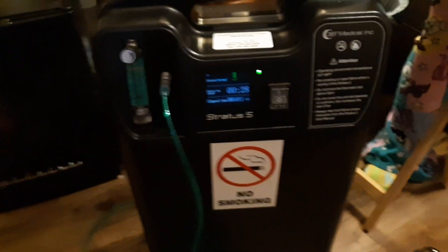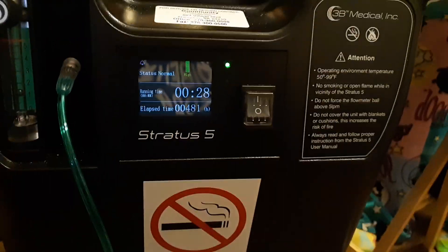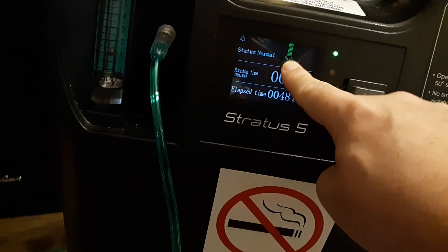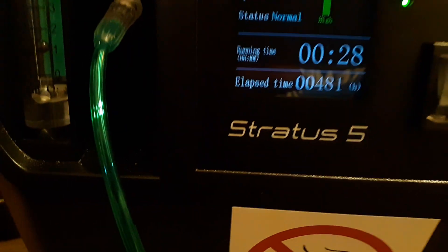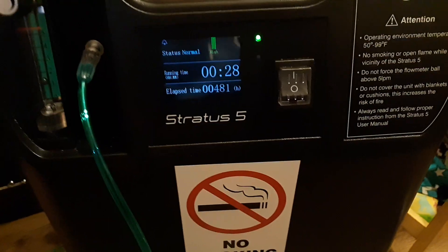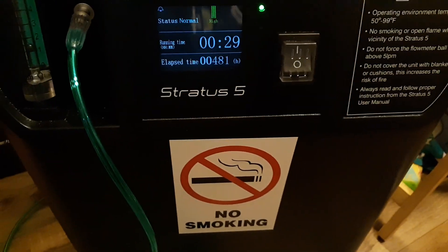In this video I want to talk about the green or red indicator on the Stratus 5 oxygen concentrator. Right now it's at green high and it says status normal, which basically means the oxygen level is good, it's clean, and there's no kinks in the lines — the patient is getting good oxygen.